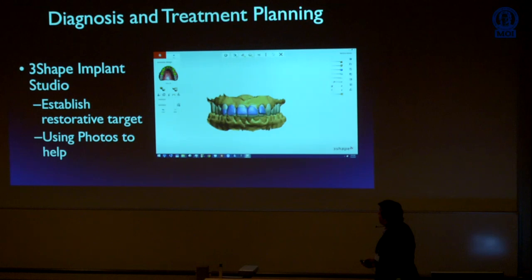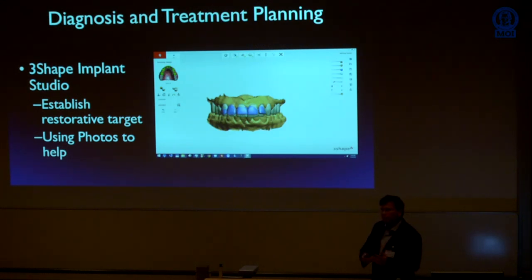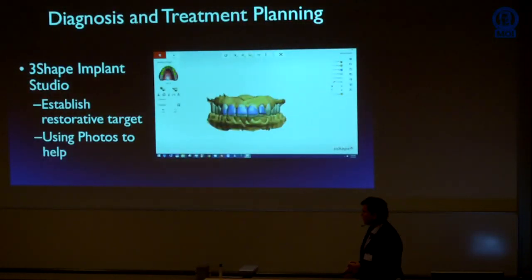This particular patient, those front teeth were short. In one of the sets of models from which we didn't take the teeth off, we checked the occlusion and looked at what the occlusal reality was with that case. So when we propose changes, we only make changes that we feel will work.